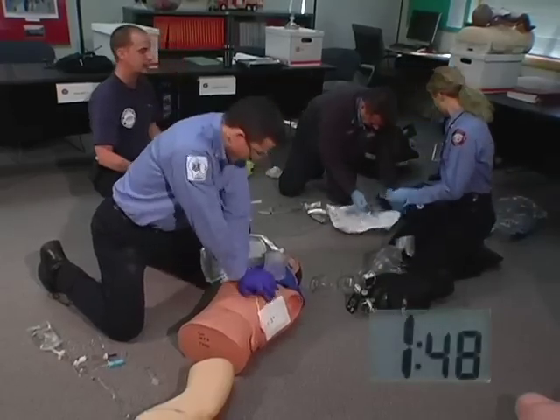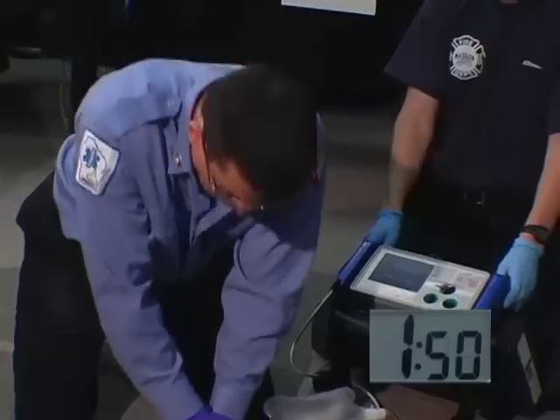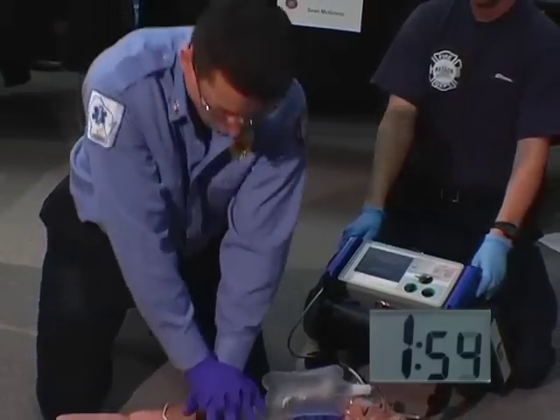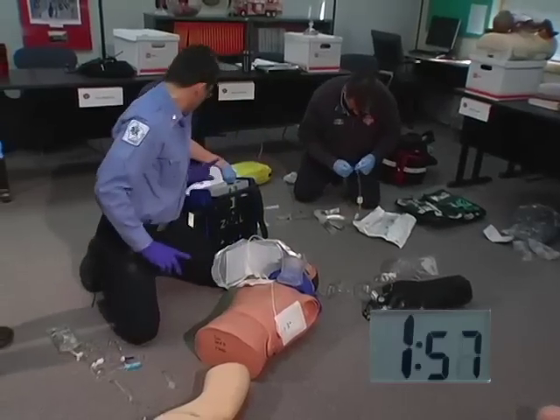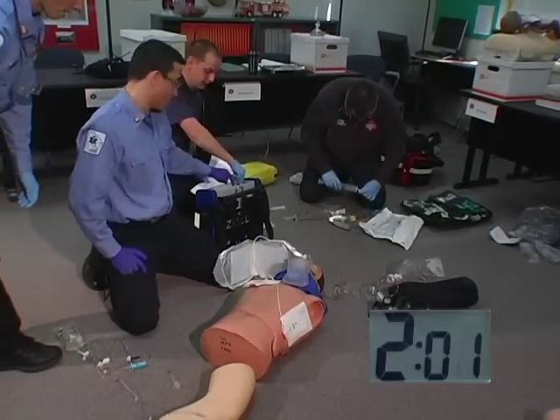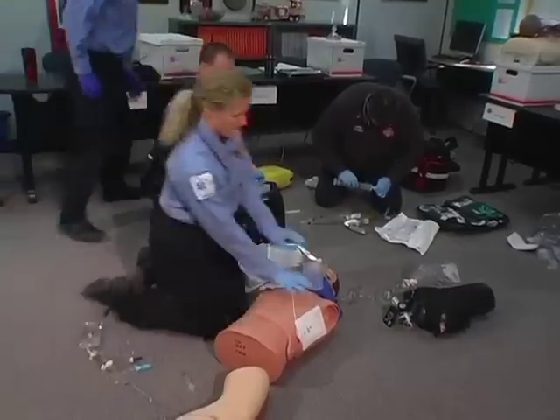85. Go ahead and charge up. 95, 96, 97, 98, 99, 100. Off. Look. Charge. Shock and clear. I'm clear. You're clear. Shock. Delivered. Shock delivered. And immediately restart.